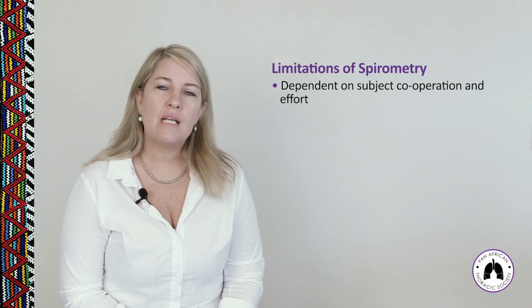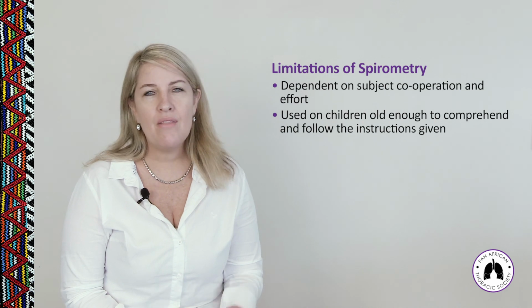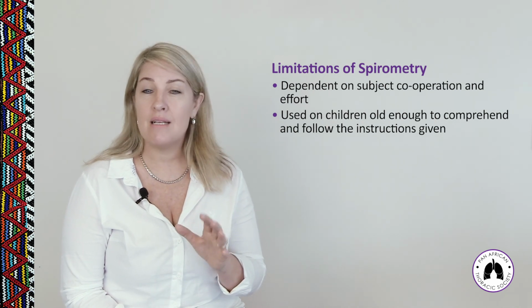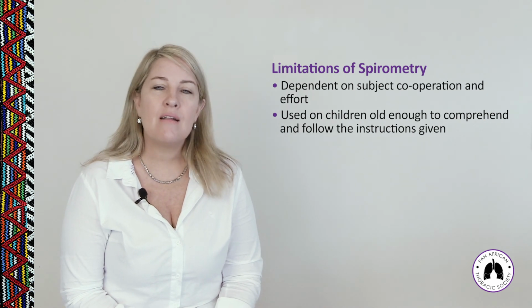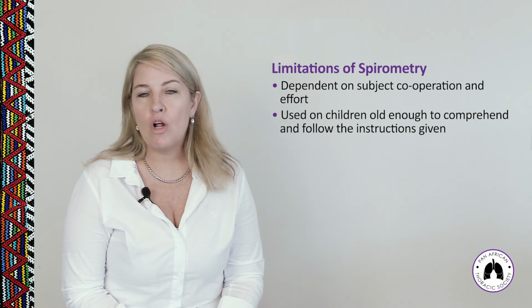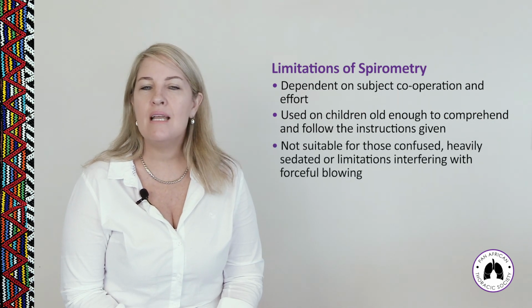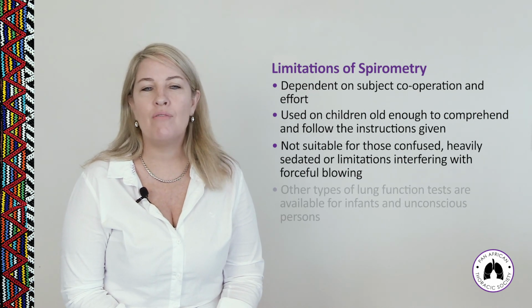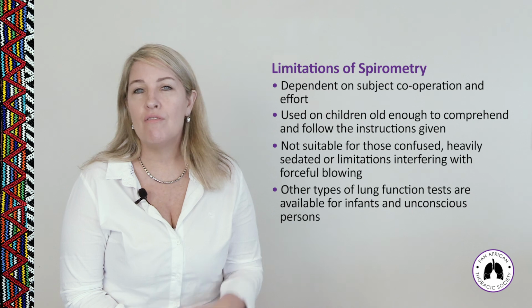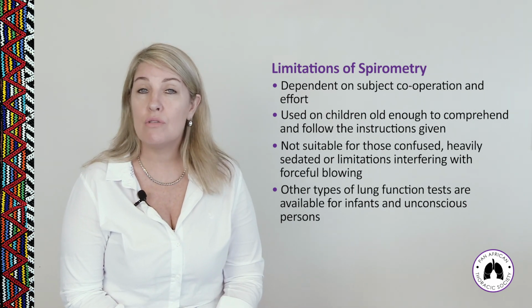So spirometry can be used on children old enough to comprehend and follow instructions, and that's usually around the age of 5, but as I said, we can do it on children who are younger. The child has to be able to understand and follow instructions, so it's not suitable for anybody who is confused, heavily sedated, or has any limitations that would interfere with forceful blowing. And other types of lung function tests are available for infants and unconscious persons, but spirometry would not be useful for children with these problems.